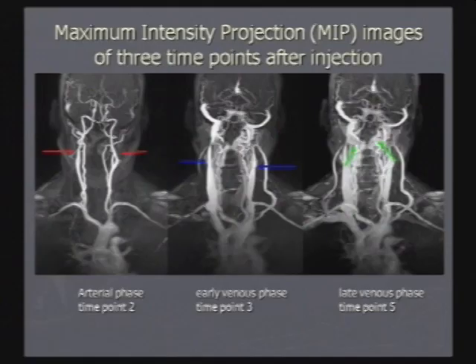But one of the things that might be interesting to do in the future is, once we think we've found such a stenosis, I can actually go back and collect the data with 200 micron resolution locally. So in fact, we could go in and take yet a few more minutes, David, to reevaluate what we think are local stenoses with very high resolution. So MR really offers you this wonderful opportunity.